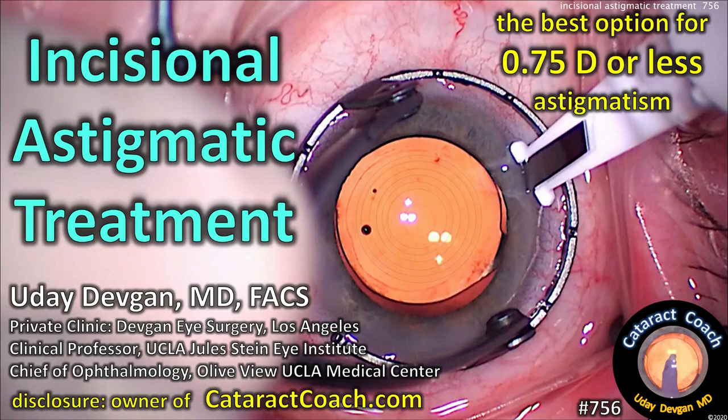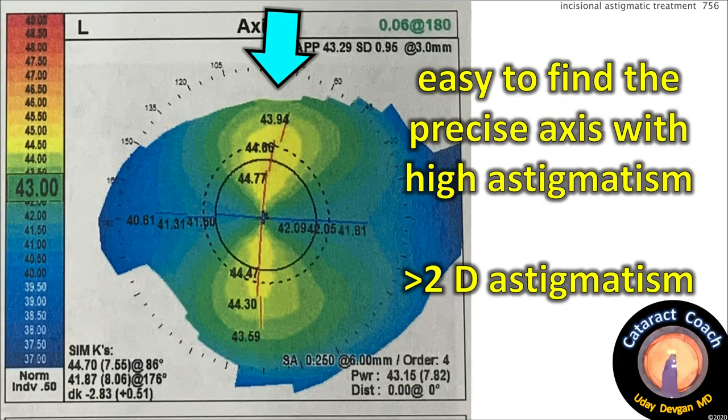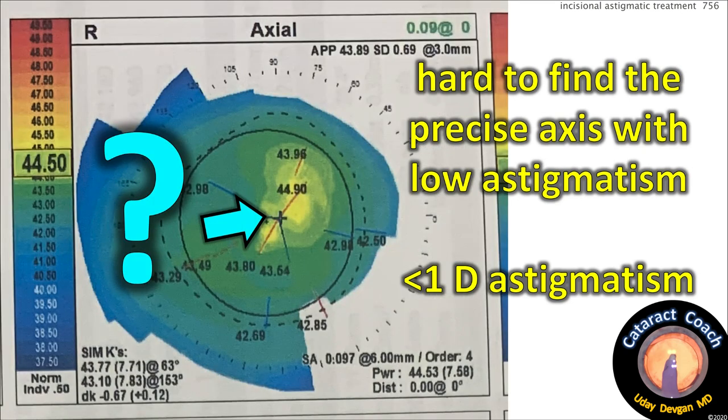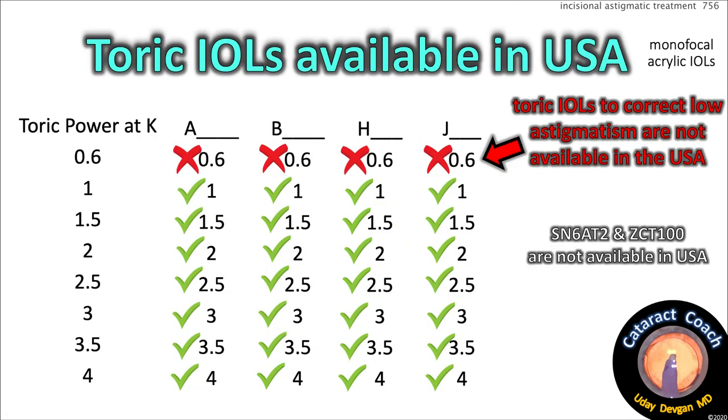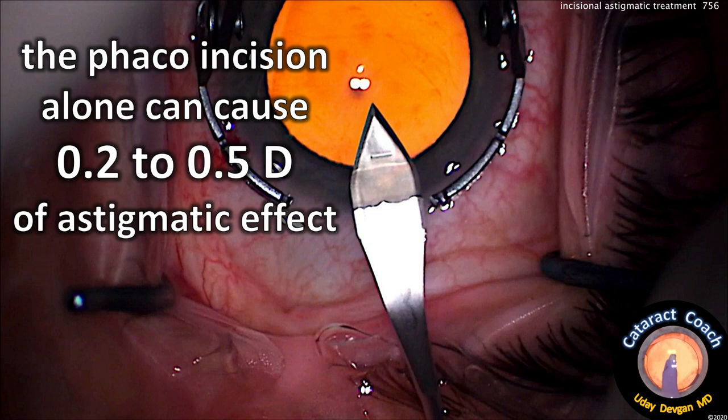Incisional astigmatic treatment: the best option for low degrees of astigmatism. Disclosure: I own CataractCoach.com. I use toric lenses every week — they're best if the patient has one diopter or more of corneal astigmatism. For high astigmatism it's easy to find the precise axis and all machines give the same reading. But with mild astigmatism less than one diopter, it's hard to find the precise axis and different machines may give slightly different answers. In the USA, no company makes a toric lens correcting less than one diopter at the corneal plane — the SN6-AT2 and ZCT100 are not available. The reason is your phaco incision: whatever size incision you make, it causes flattening with an astigmatic effect of 0.2 to 0.5 diopters, varying among surgeons and patients.